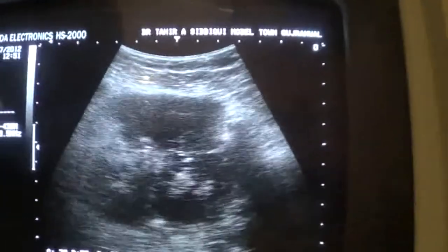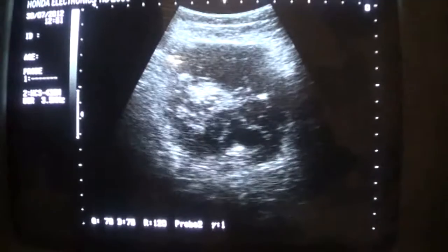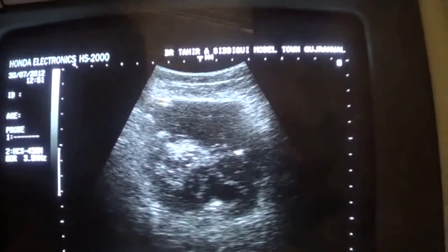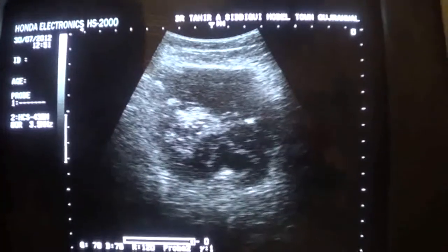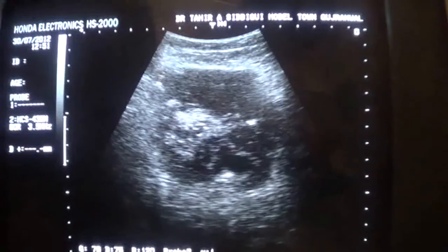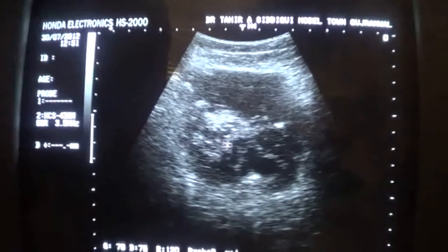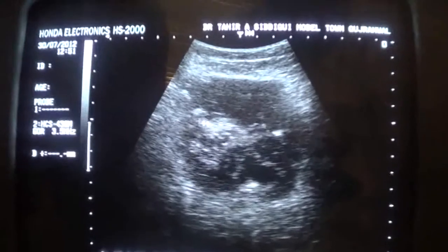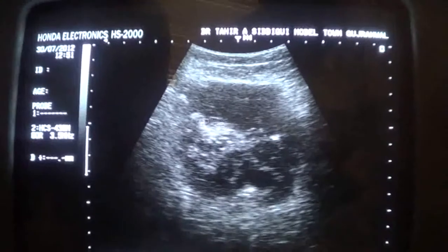So this is a hematoma in the anterior abdominal wall, extending from the umbilical region in the midline upwards. Its internal configuration, again echogenic areas. These echogenic islands are not septa, rather this is an echogenic area with no posterior shadowing, and this is consistent with necrotic material or a clot formation.